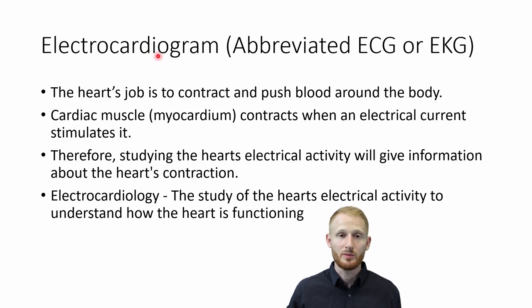The electrocardiogram can be abbreviated as ECG or EKG. They're the same thing, just different texts and different individuals use one or the other. I typically use ECG, but I may occasionally slip up and say EKG, but remember those are the same thing. All right, so let's talk about what electrocardiography is.